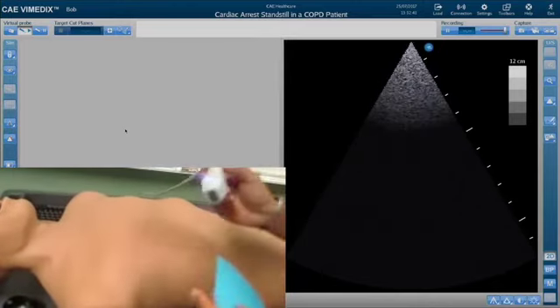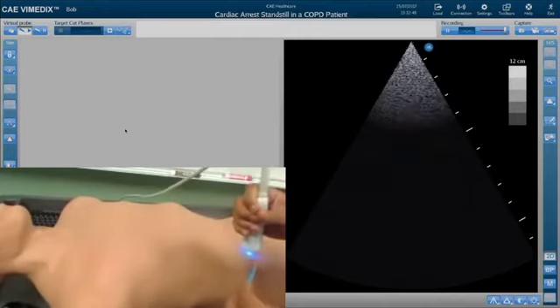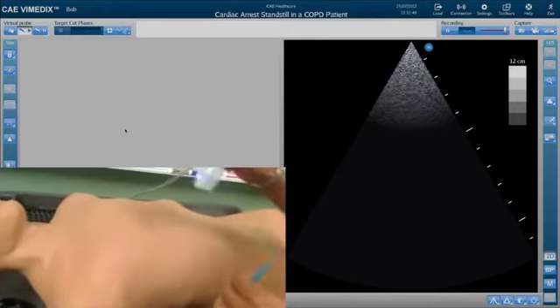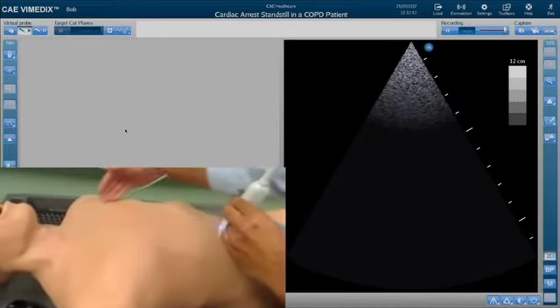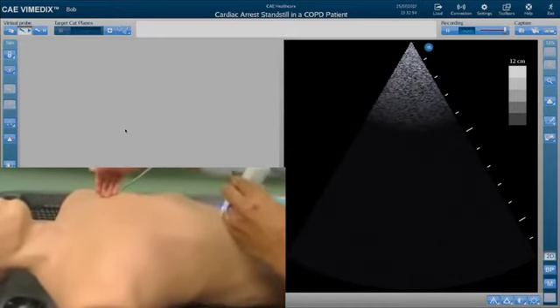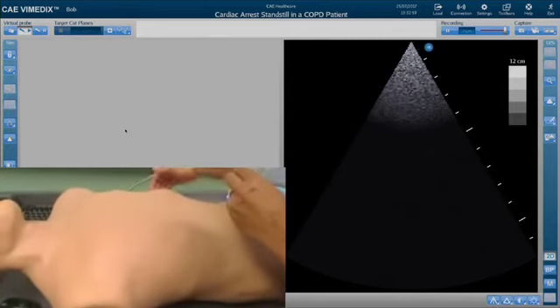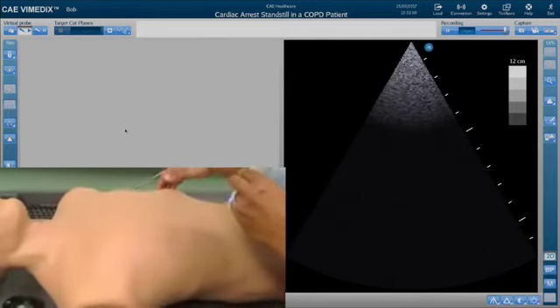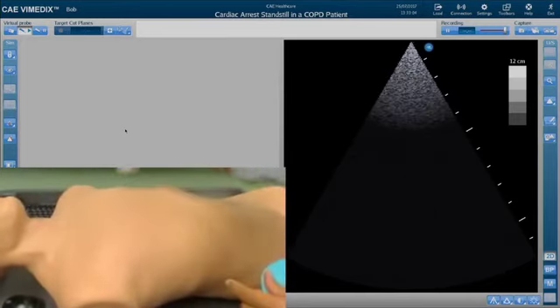We're going to place the ultrasound probe exactly how we do for the evaluation for pneumothoraces, or looking at the lung pleura, which again means starting at the mid-clavicular line for the proximal 1/3 of the chest wall, and then moving laterally up to the anterior axillary line as we go to the inferior border of the chest wall. So the indicator again will be at the 12 o'clock position, starting here.